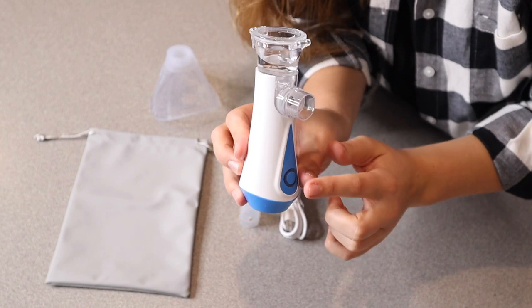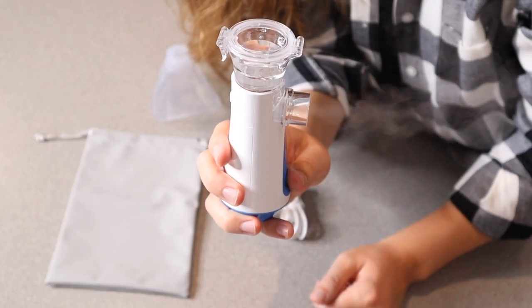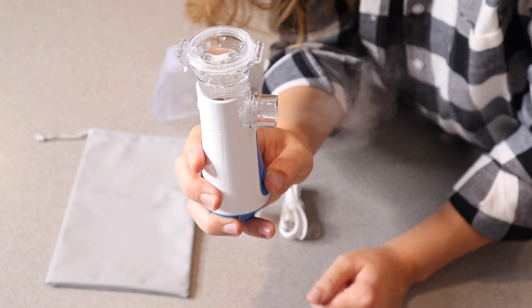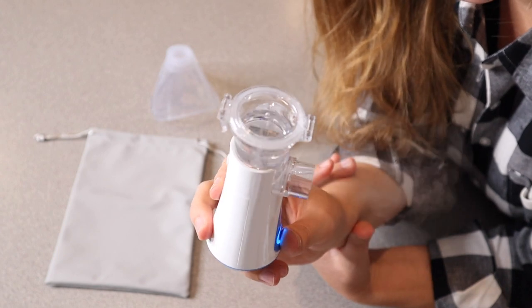So when you turn this on, it's automatically going to turn on to the high spray mode. You can see when you turn it on it has a high spray, and then when you push it a second time it goes to a little bit lower spray. I do really like how easy this is to use.